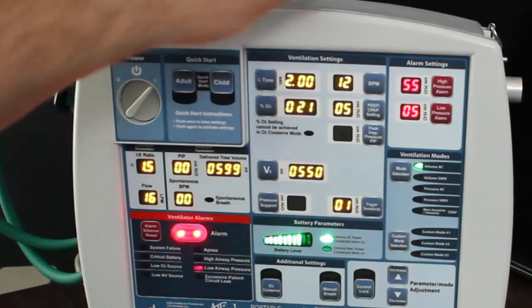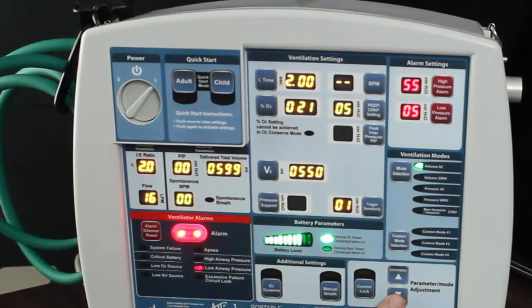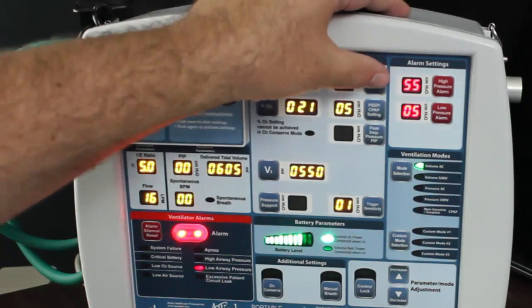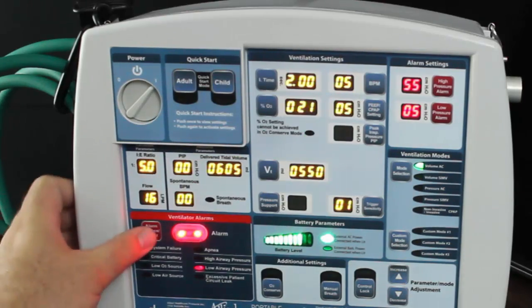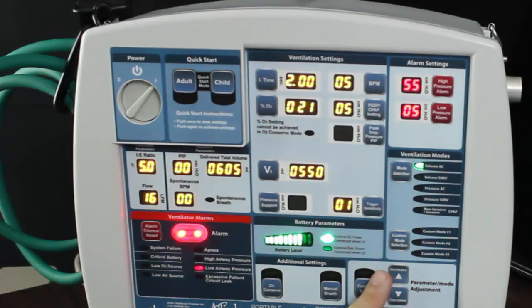If we want to make a change, I will highlight breaths per minute — it will blink. I will use my down arrow or up arrow depending on which way I want to go. Go to my number and hit the setting. Now I am giving 5 breaths a minute. I want to go back up to 12 or 14 — I hit it and it blinks, go up on my arrows to my setting, and then I am at the number I want. That is how you set the program.